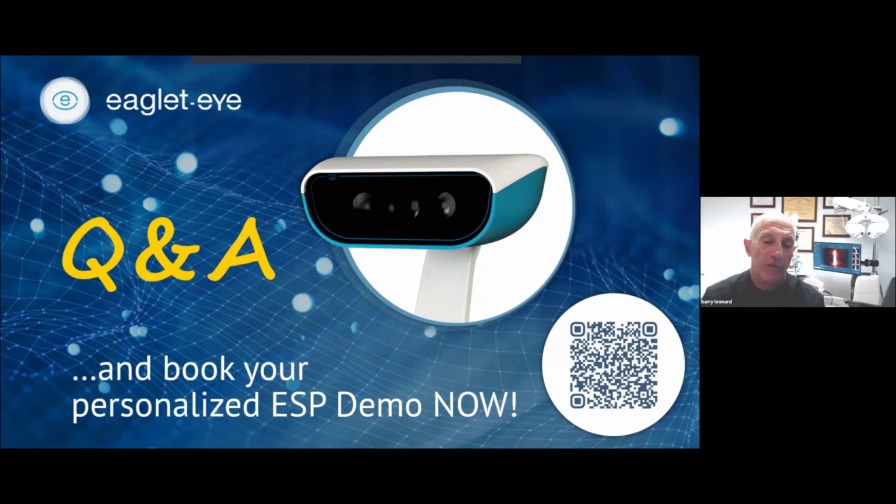I definitely do more sclerals. I look at some of the studies done by Pat Caroline and Mark Andrews up at Pacific University. A lot of you might know them, and they did a real good study that said if you have more than 300 microns elevation delta in a cornea, it's very difficult, as we all know, to fit a small corneal RGP. I use that as my guideline and talk to patients and show them the pictures, the elevation map, and say, you have 800 microns or you have 200 microns, and here are our choices.